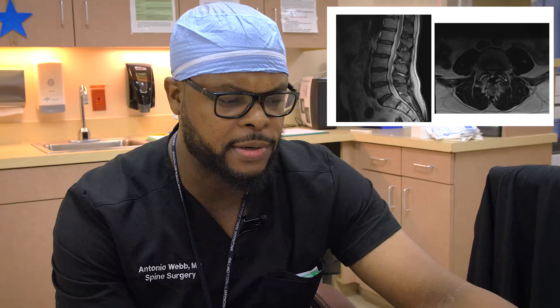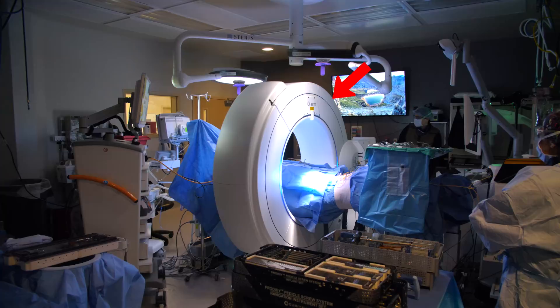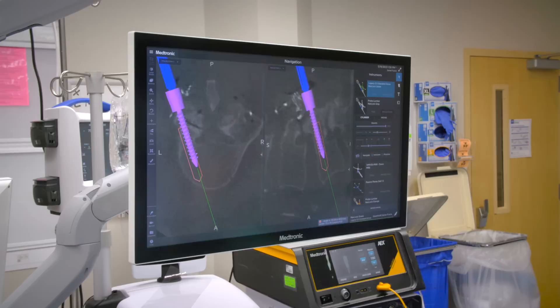These are the facet joints right here. You can see that there's fluid in the facet joints, which should not be there. That tells me there's some movement at that level, and every time he moves, extends, or flexes his back, there's pressure on those nerves. We're going to use the O-arm, which is navigation — similar to the GPS in your car. I'll be looking at the computer screen while I'm placing his pedicle screws so that they go in an accurate and precise manner. That's called computer-guided navigation.